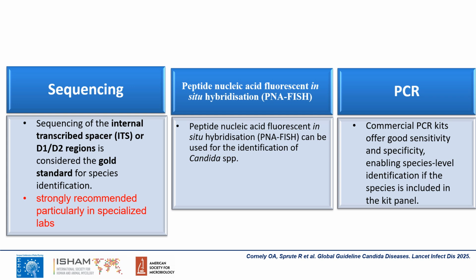However, wherever these facilities are available, sequencing is considered very important for species identification, and especially for isolates which are new, which are not available in the database of MALDI-TOF or the commercial identification system. So sequencing is strongly recommended, particularly in specialized laboratories.